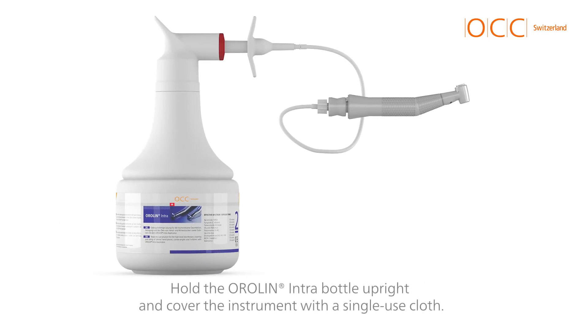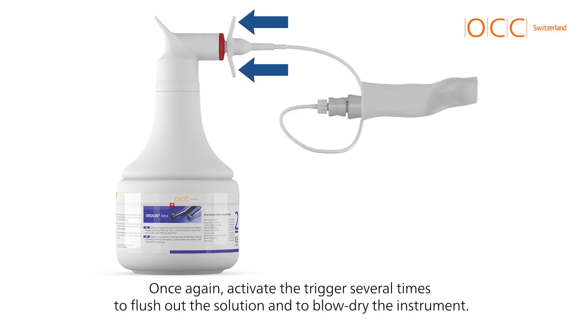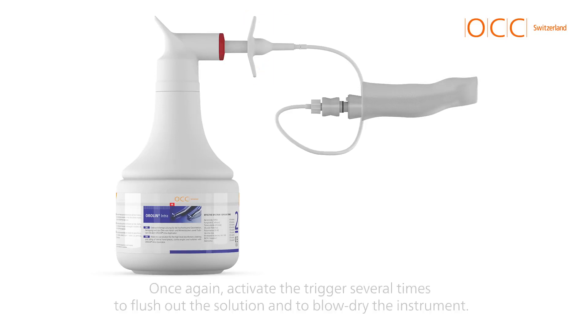Hold the Aurelin intra-bottle upright and cover the instrument with a single-use cloth. Once again, activate the trigger several times to flush out the solution and to blow-dry the instrument.